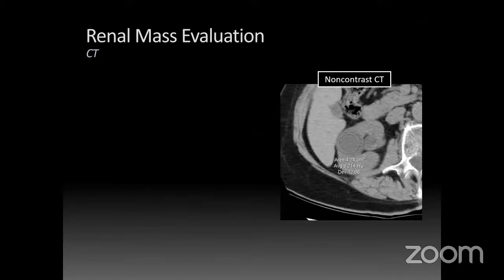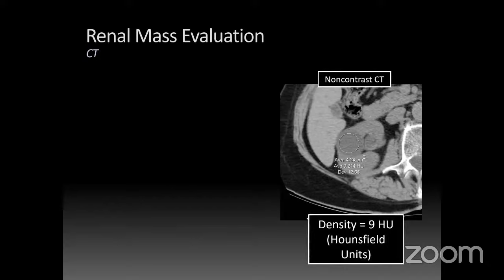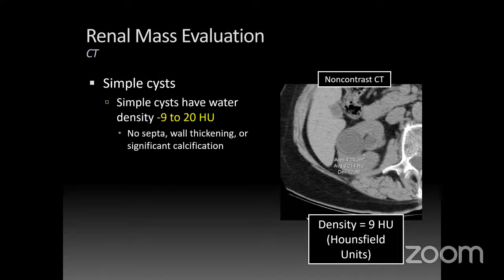CT is a more robust way to evaluate renal masses. Starting with a non-contrast CT — here's a simple cyst with a density of 9 Hounsfield units, the unit used to evaluate attenuation on CT. Simple cysts will have a water density. According to the ACR guidelines for renal mass evaluation, that density would be negative 9 to 20. As long as it doesn't have septations, wall thickening, or significant calcification, you can call it a simple cyst.